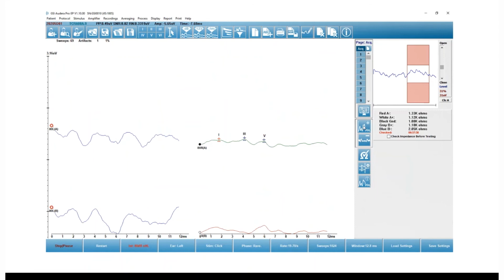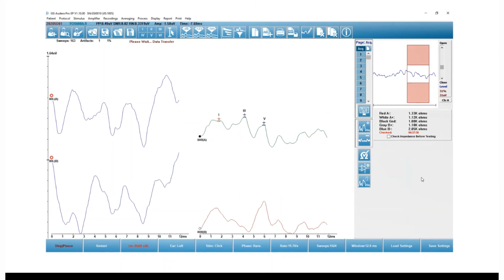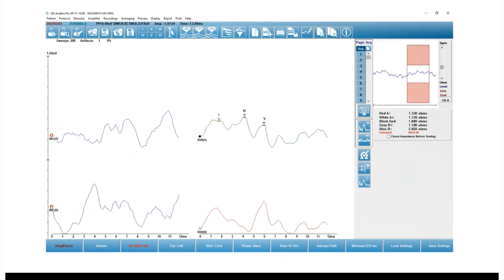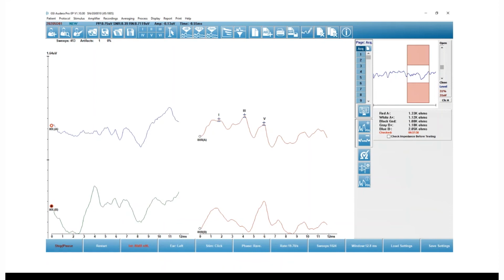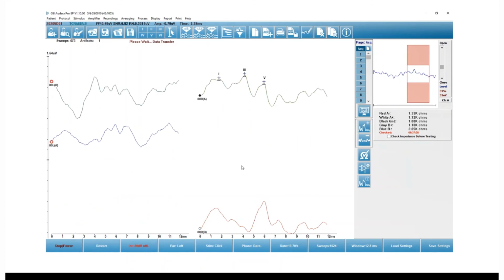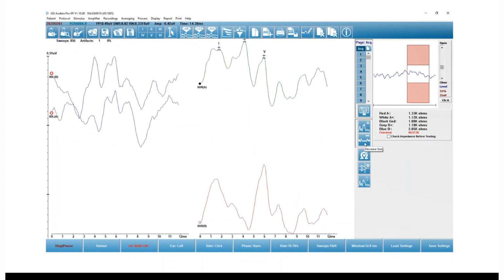So again, there are two waveforms that are automatically appearing on the left side, and when I'm stimulating the left ear, channel B is my ipsilateral recording, so it's the opposite of the right ear. So I've highlighted the ipsilateral waveform for the left ear, which is channel B. Again, I can take a look at the number of sweeps to see how far along I am in my protocol. I can also rearrange my waveforms, so I have my ipsilateral recording side by side now. Again, I'm always playing with that display scale.